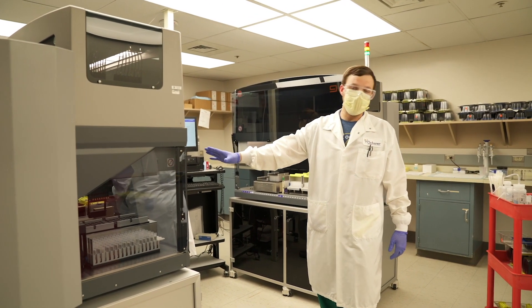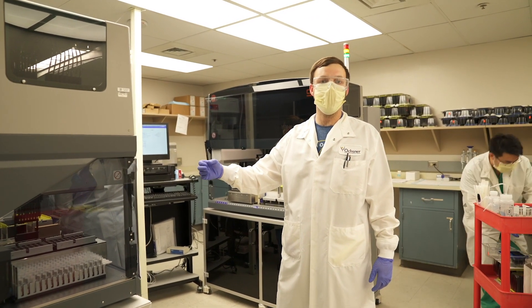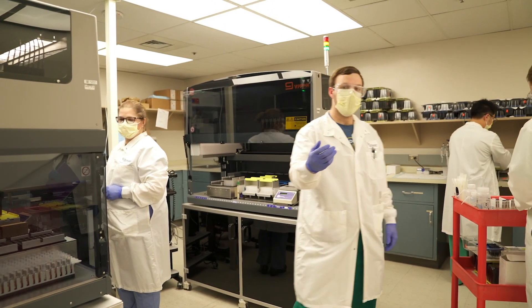We have another phase after this extraction is done where we add our primers and probes, which helps identify this particular virus. Then we bring them — if you'd like to come this way.